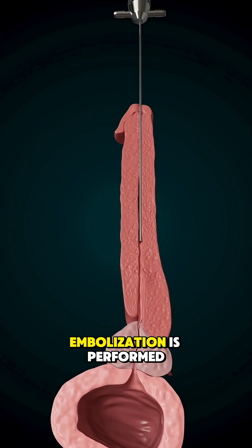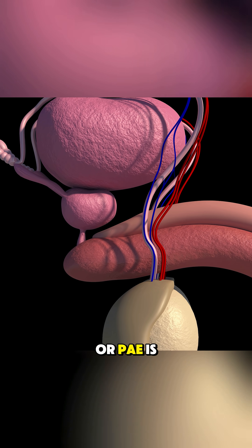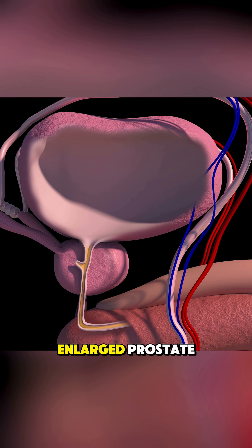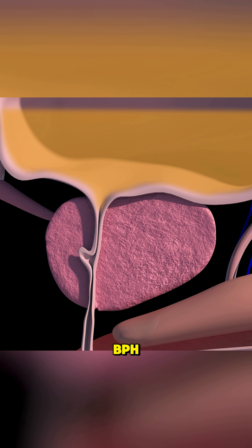Ever wondered how prostate artery embolization is performed? Prostate artery embolization, or PAE, is a minimally invasive treatment for men with an enlarged prostate, also known as benign prostatic hyperplasia, or BPH.